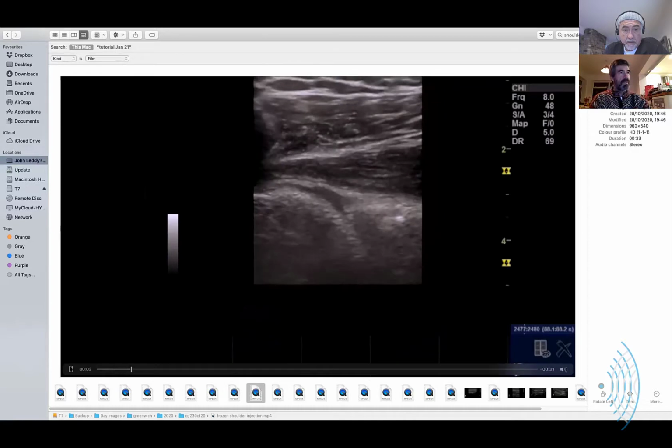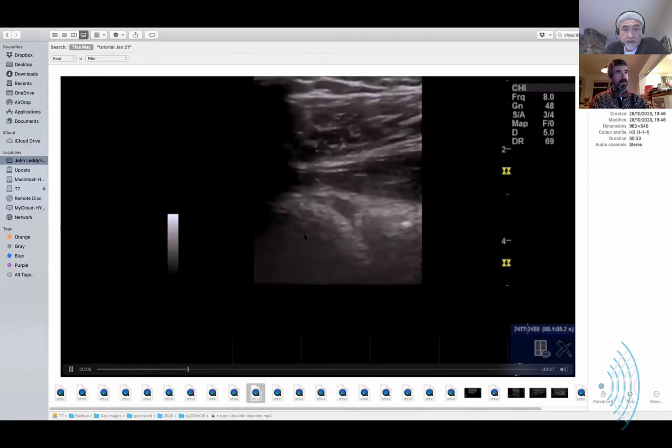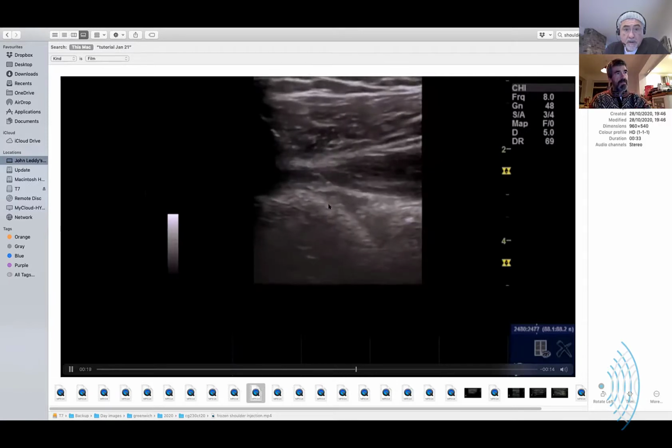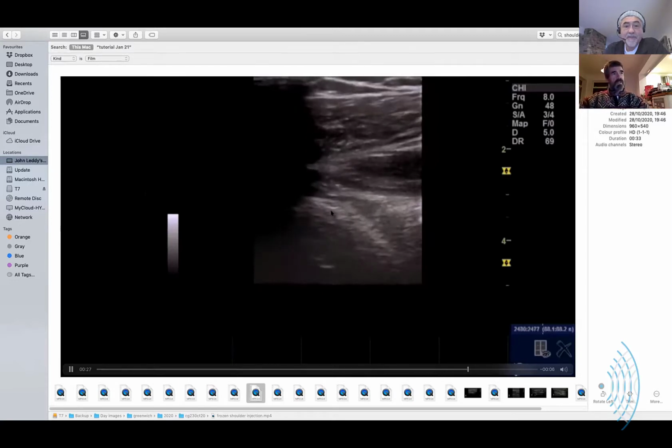Where the needle's a little bit more obvious, yeah? Yes. Okay. So the needle pops just into the joint there. And then if we just have a look, find a position there, it's going in. You just see a little bit of fluid going in. And in a moment, I'm just trying to get the right place. So there, and there, do you see the capsule starting to stretch?